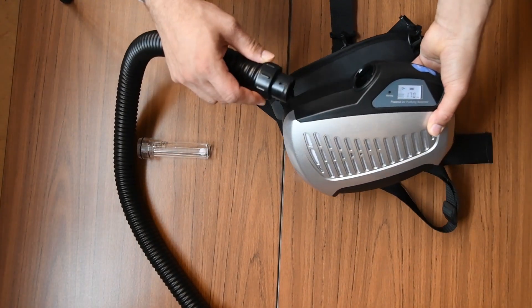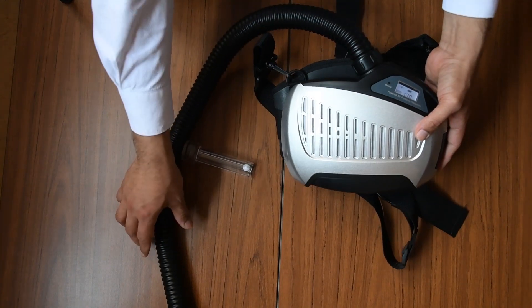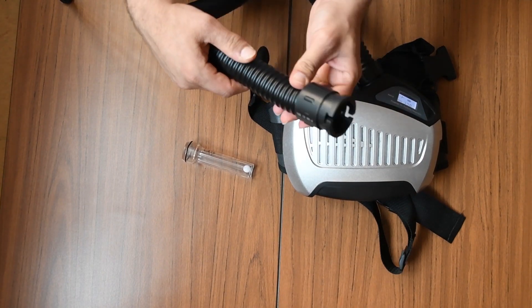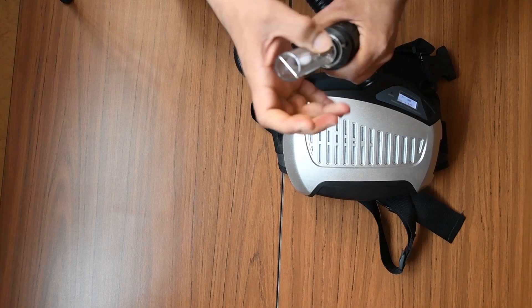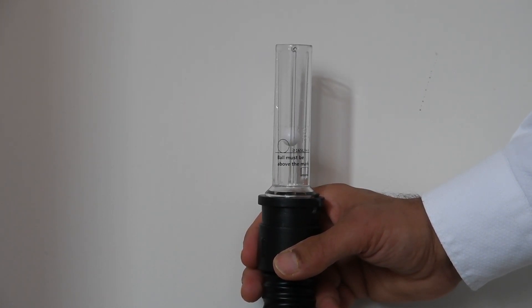You can connect the flexible hose with a clockwise motion, and when it's working well you can actually feel the air coming from the flexible hose. This is the airflow tester — you attach it and you can see the marble goes all the way to the top, which suggests it's a very good airflow and the device is ready to use.